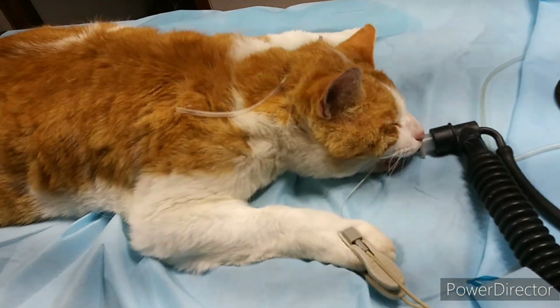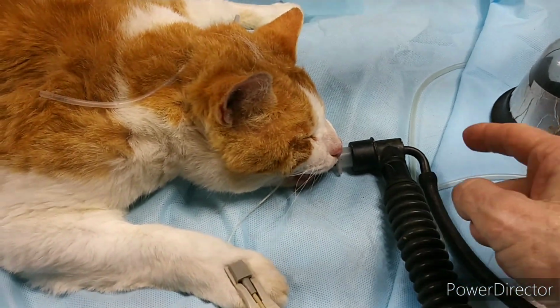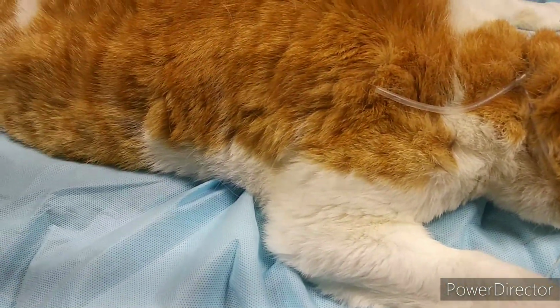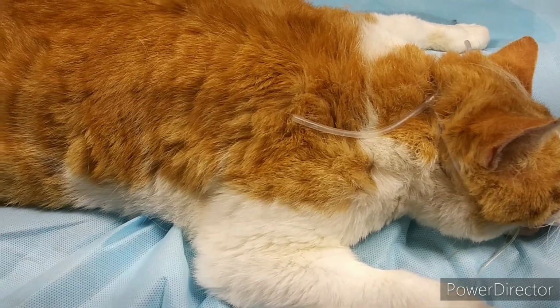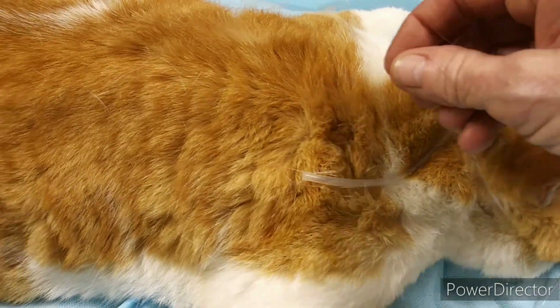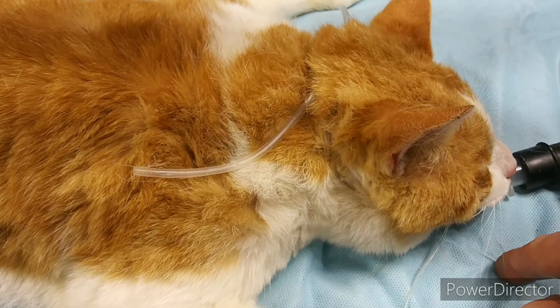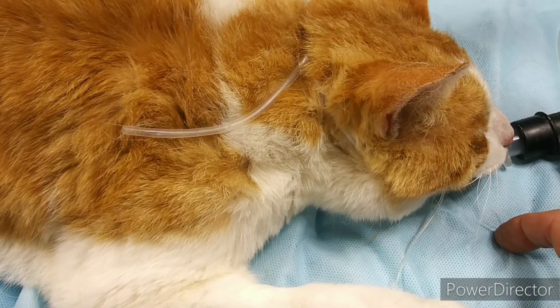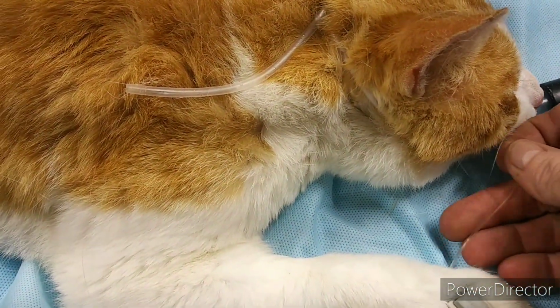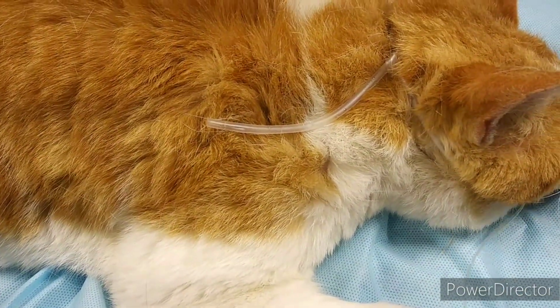Okay, this is Munchie. I prefer the endotracheal tube over the mask in case the patient gets nauseated. They're not really deep. They get a local block back here, but you control vomiting and aspiration a lot better if you've got a trach tube in their mouth. That's a 3.5 internal diameter trach tube. I've got the bulb slightly inflated, not over inflated.